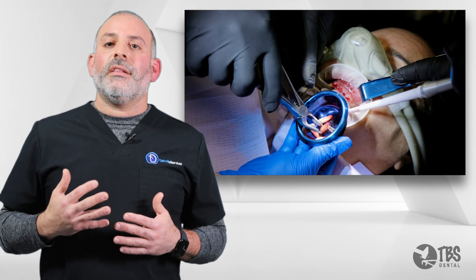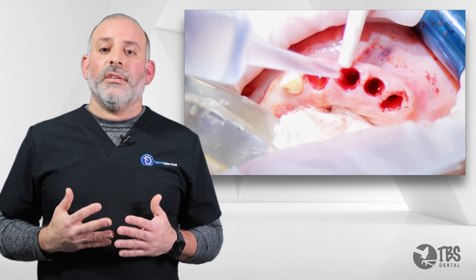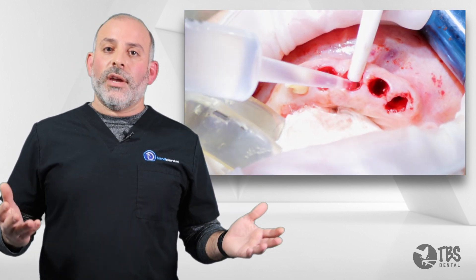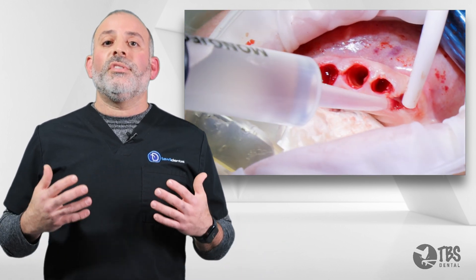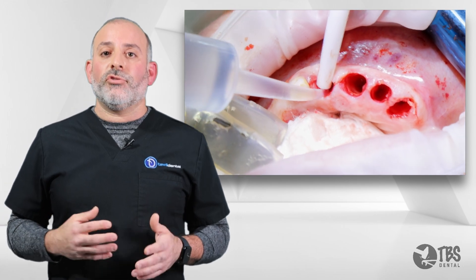What you'll notice is a nice, clean extraction site, which can then be used with curettes and grafted for ensuring a good, solid ridge for a complete, minimally traumatic extraction.